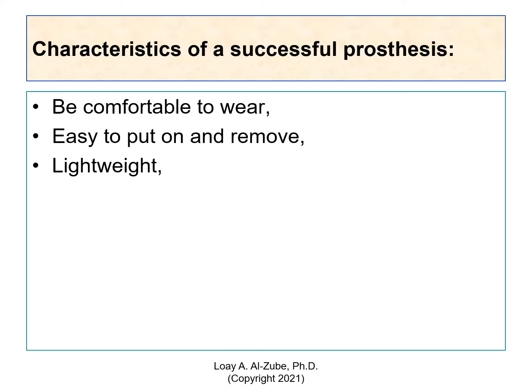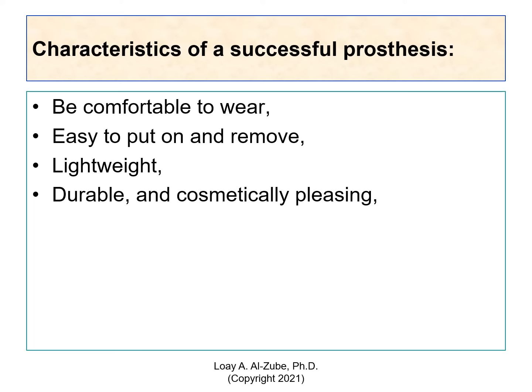Lightweight, we agree on that. Plastics are becoming popular, and also fibers, carbon fibers, are becoming a thing. Durable, how would we test durability? It's mechanical forces, using fatigue testing, the cyclic loading. That will give you how durable it is, especially for the upper and lower extremities, so they're continuously getting loads.